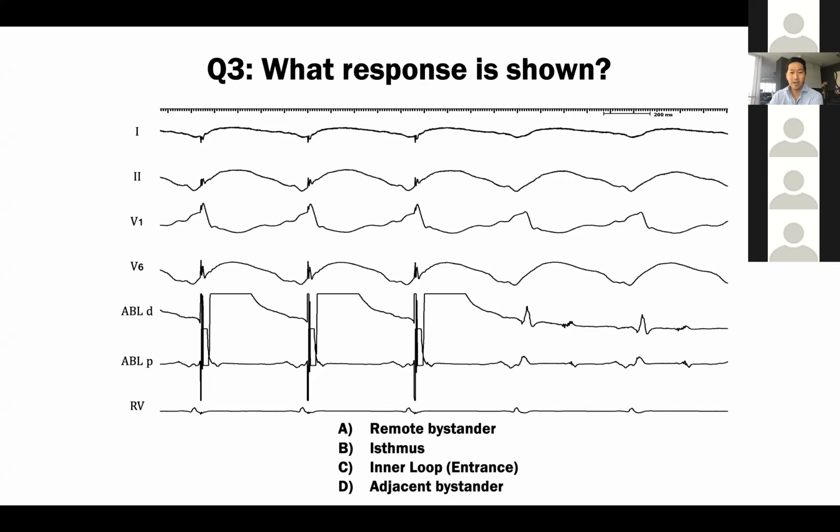That's the first observation. And that looks weird because remember, if you're 30 to 70% within, then you should be somewhere in the middle of diastole, which is why I asked you guys and gals of where the middle isthmus is. It should be somewhere around here, which means when I'm pacing, the stimulus should be somewhere around here, and it's not. So I can already tell without even going to make measurements that this is not a central isthmus. And that's really useful in clinical cases. If that stim is inside the QRS, you're not in the central isthmus, but you could be in an entrance. So we'll talk about that.